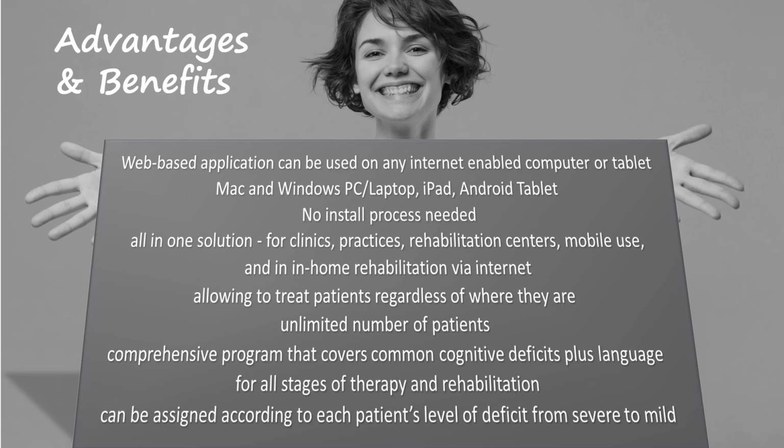In summary, what are the advantages and benefits? HeadApp is a web-based application and can be used on any internet-enabled computer or tablet, inclusive Mac and Windows PC, laptop, iPad and Android tablet. No install process needed. HeadApp is an all-in-one solution for clinics, practices, rehabilitation centers, mobile use and in-home rehabilitation via internet. HeadApp allows to treat patients regardless of where they are, and you can add an unlimited number of patients.